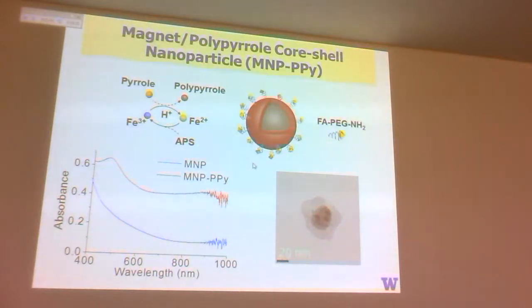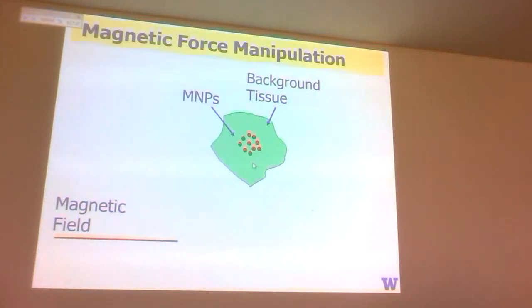The polymer we've picked is one which has a very broad absorption spectrum, so we can work out in the 1053 range, where we have the cheap lasers. Now, why do we care about this magnetic thing? Why add this magnet? This is a particle that will give us, per particle, not per weight concentration of the polymer versus gold or something, but just per particle, the same as the gold nanorods. All right, so we can get the same kind of basic photoacoustic signal per particle off of this. But why do we have the magnetic stuff in there?